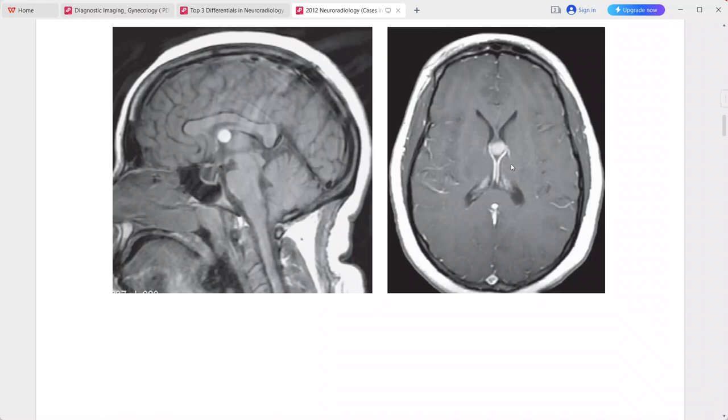This is a case of colloid cyst. A solitary lesion in this location with these imaging characteristics is quite specific for colloid cyst.